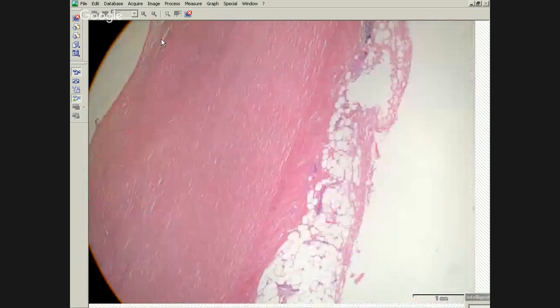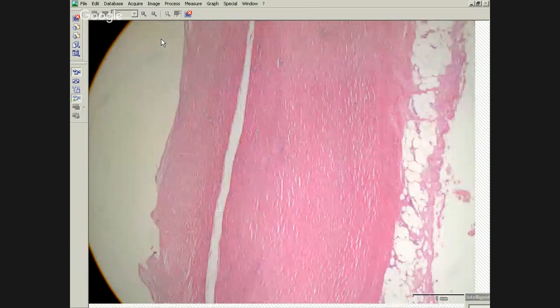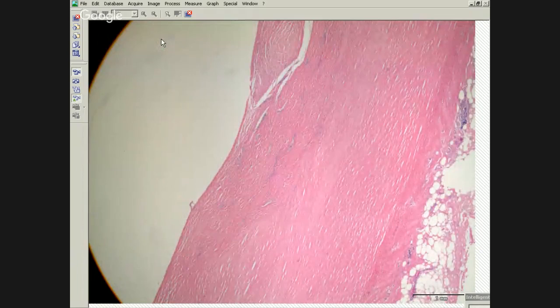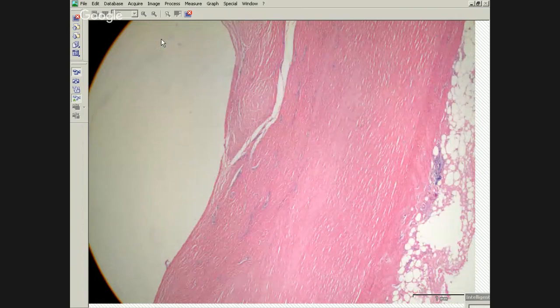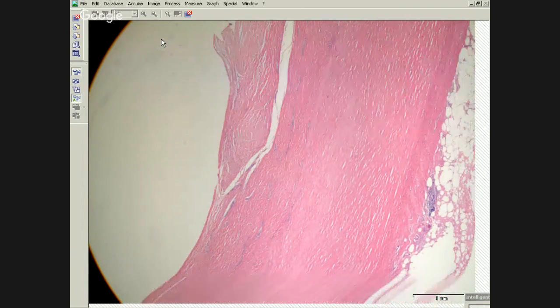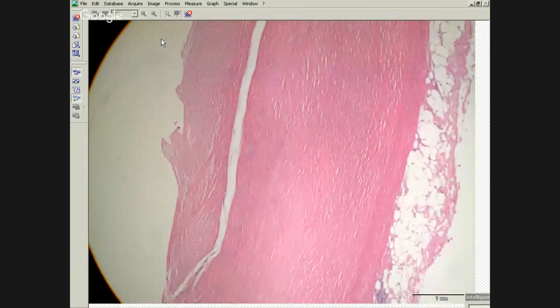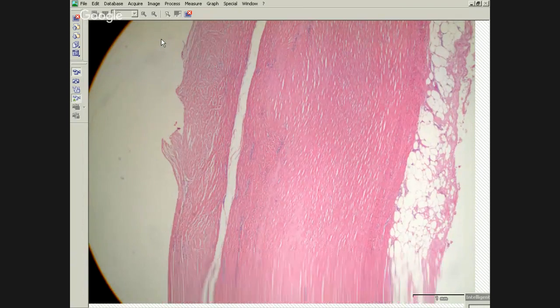And another soft feature for benign pleural fibrosis is when there's retained capillaries, they tend to be perpendicular to the orientation of the pleura. So you've got linear deposition of the fibrosis, linear entrapment of mesothelial cells, and then if they're present, perpendicular orientation of the capillaries. So this is a benign pleural plaque. We'll compare this to a case down the road in a minute.